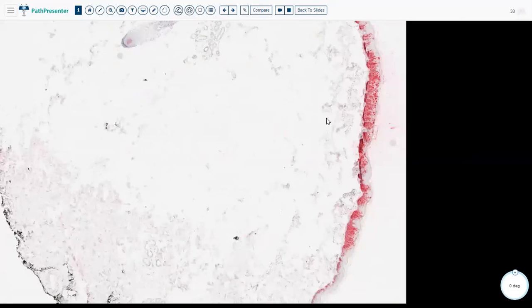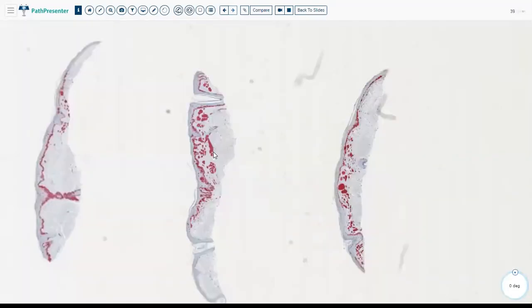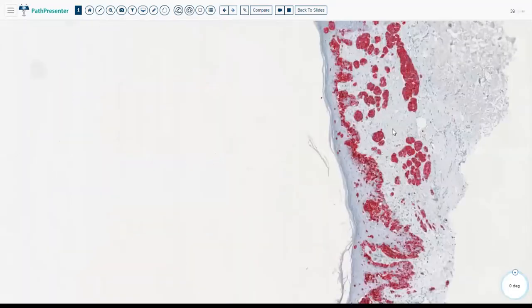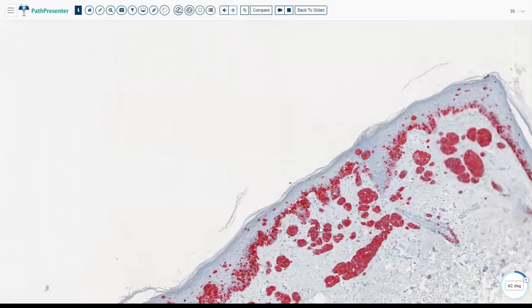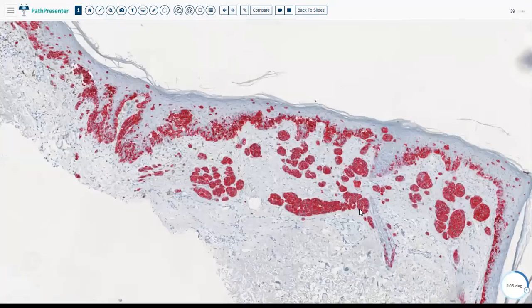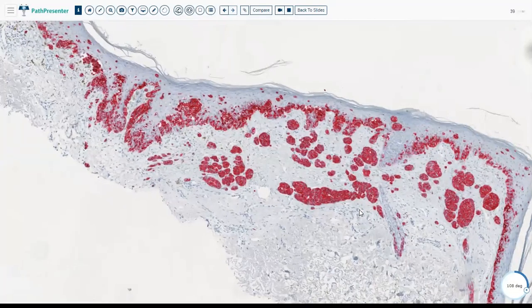So it's good prognosis. Here, this is an invasive melanoma. See how deep it's going, and it's nesting all the way to the deep dermis. So even though this is classically a lentigo maligna melanoma, it has a worse prognosis than the case we saw previously. And I apologize for taking a little bit longer in time. We just took a full hour right now.